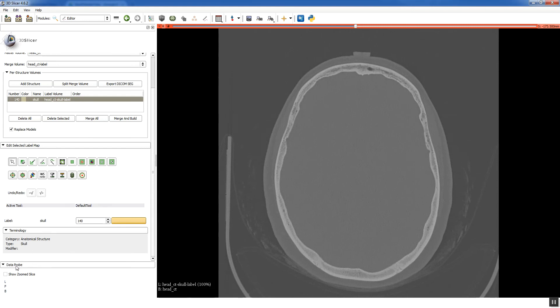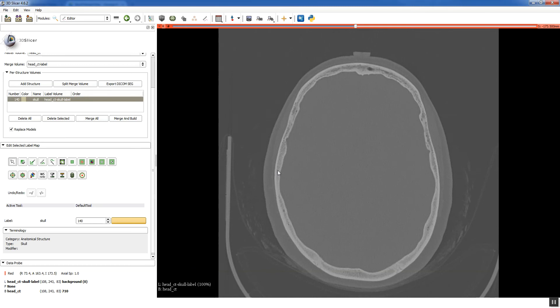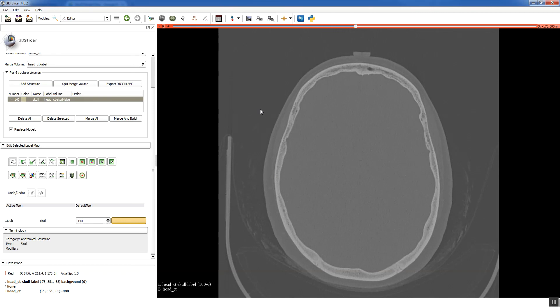And then lastly, I want to draw your attention to the data probe down here. It's not displaying anything right now, but watch what happens to it as I drag my mouse over the study. You start to see values popping up. Now the unit of value or the unit that determines the color of something on a CT is called Hounsfield units. And that's determined by the attenuation or density of that structure. So bone is really dense. You can see that the values are ranging in the thousands on average, 1430 right now. If I go over to air, you can see the number negative 930 displaying because air is really not dense.